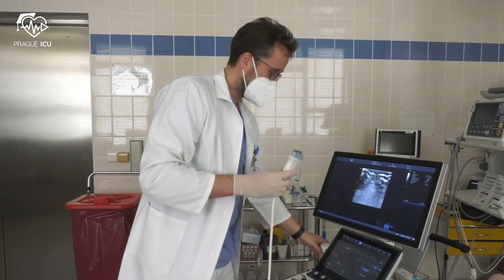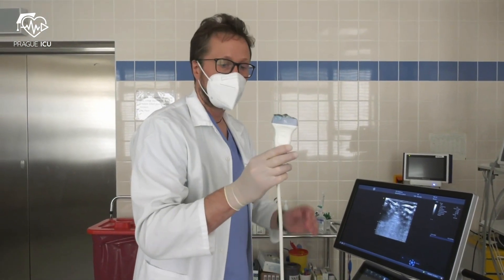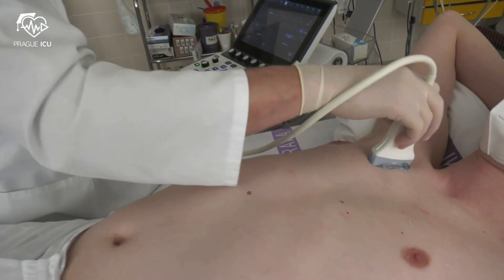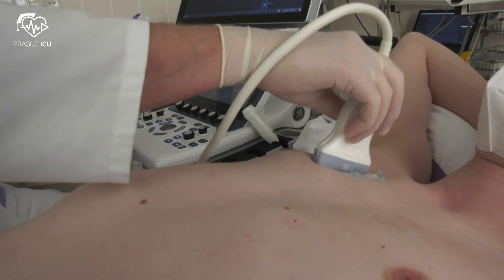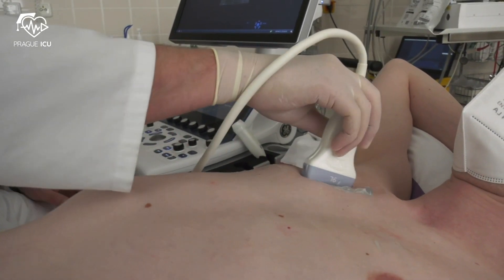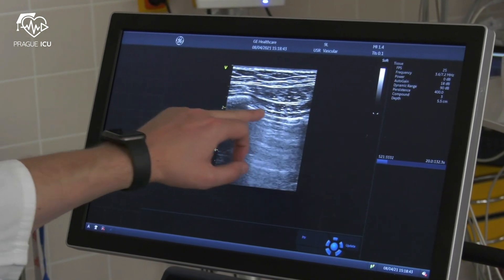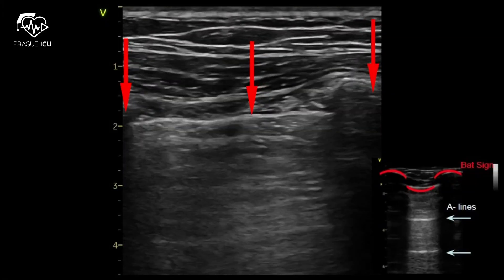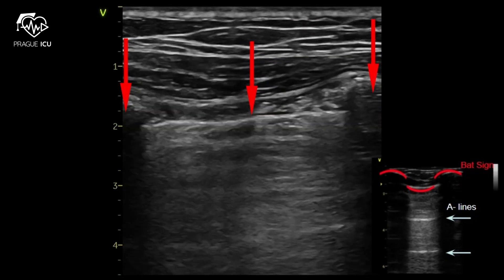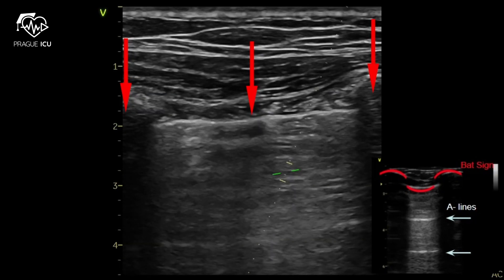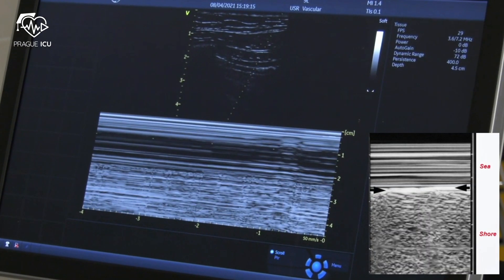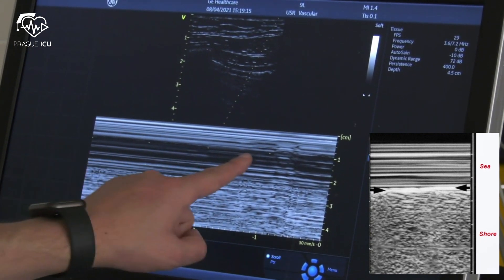For evaluating pneumothorax, the high-frequency linear probe provides the highest resolution images of the pleura. We accommodate the probe in a longitudinal axis with the marker going towards the patient's head. In this image we can see the bat sign — the two ribs on either side of the intercostal space appear as hyperechoic lines with a posterior acoustic shadow. Between the two ribs, lung sliding is present. On M-mode, the classical sign of a normally aerated lung is the seashore sign.